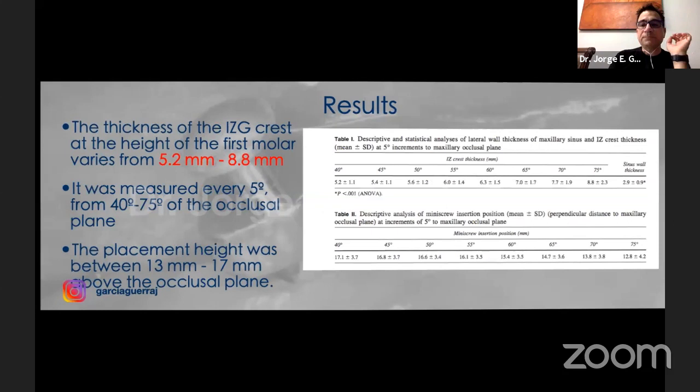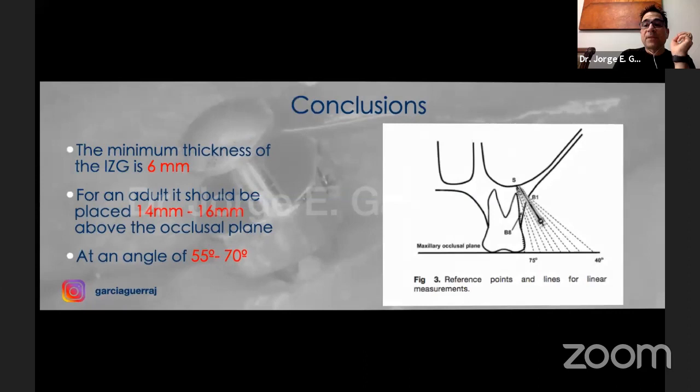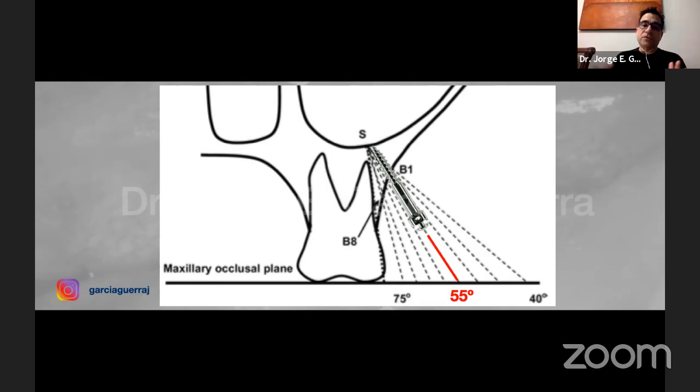You can see here the results in between 55 and 70 degrees angulation, and it's going to be like 14 to 16 millimeters from the occlusal plane. That's going to be the best suitable site for the insertion of the mini screw when we're using infrazygomatic mini screws. Okay, you can see here that's why a lot of the authors or lecturers, that we see a lot of doctors, they recommend a 60 degree angulation from the occlusal plane. That's going to be at the insertion site. Now it's going to be a correct place because first of all, what we don't want is to go to the sinus, to the maxillary sinus, and we don't want to touch the roots of the molars.